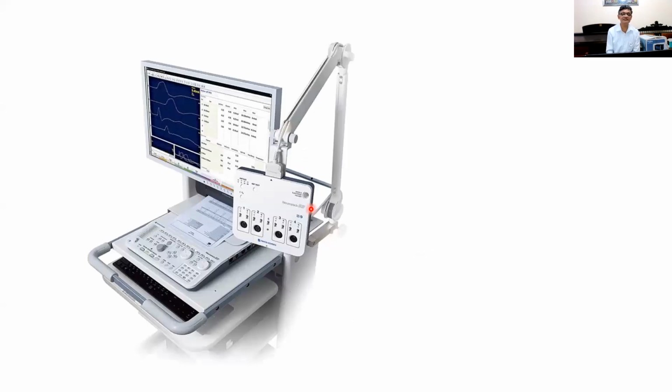And this is the ENG machine. We have in our department something very similar. I took it from the same company, Nihon Kohden machine, a Japanese machine, which has some hardware here, and a keyboard here, and underneath there's a computer. Everything is connected to a computer, a usual desktop computer, with special software. And from that software, you see on the screen the distal latency and proximal latency of the median nerve, and the distal latency and proximal latency of the ulnar nerve.